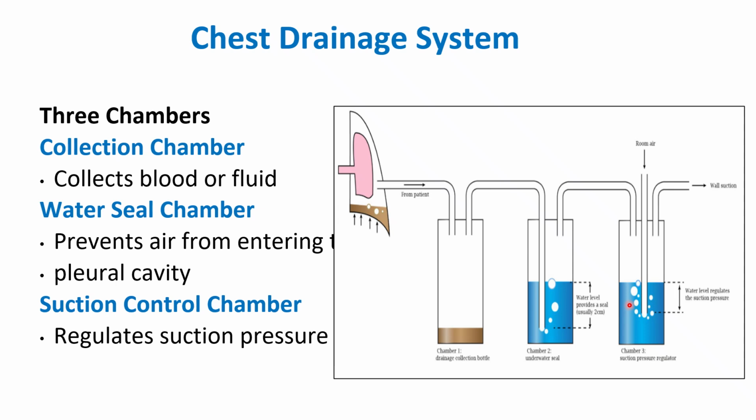So in some situations what happens? We will have two chambers. One is the collection chamber and the suction chamber. So that will play a major role.